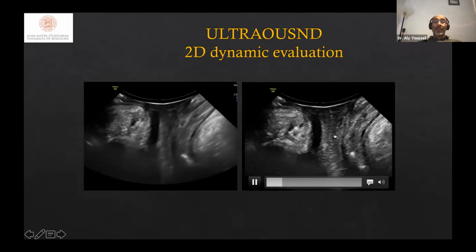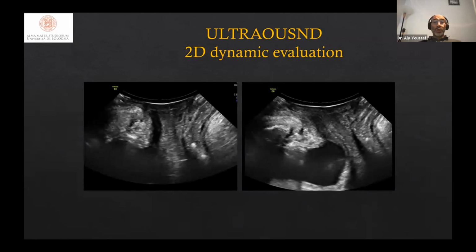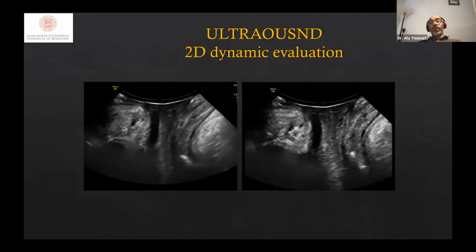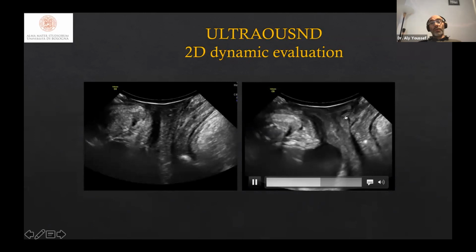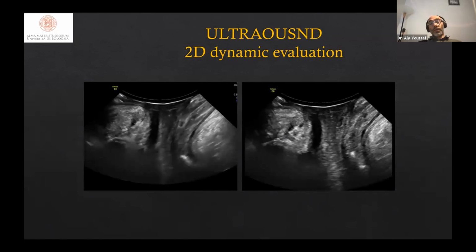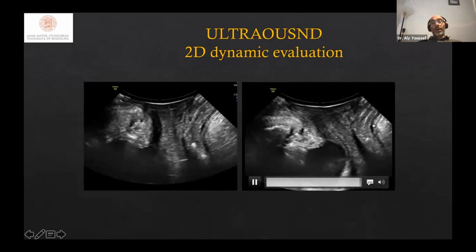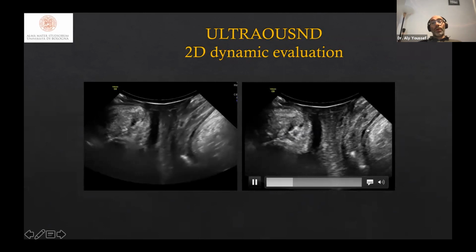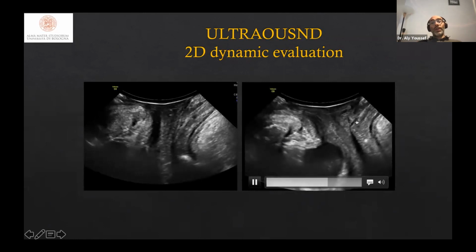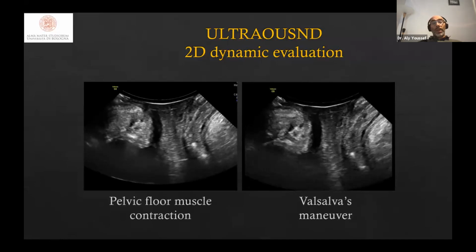In case of Valsalva, on the right-hand side, if you ask the patient to push, again, not all women are able to push, relaxing the pelvic floor. In a woman who is able to relax her pelvic floor when she pushes, the rectum and the puborectalis muscle should move to the right. This means that she's increasing the anteroposterior diameter of the levator hiatus.